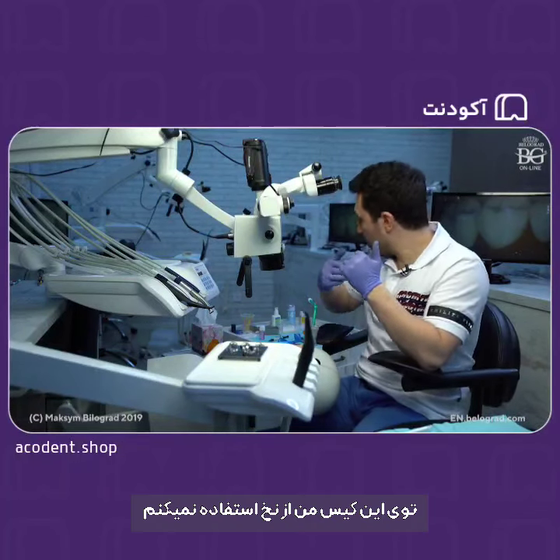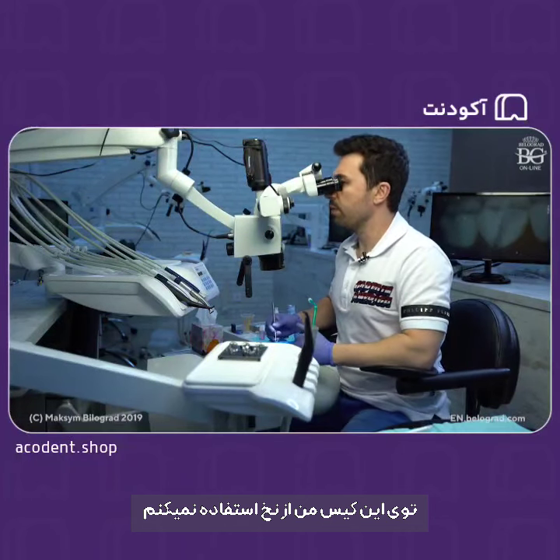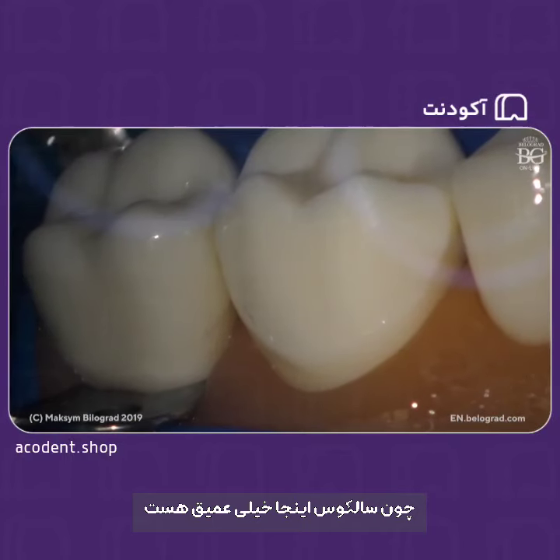In our case here, I will not use a retraction cord because you see that the sulcus here is pretty deep. But I will prep a little bit before the gum just to show you the finish lines.